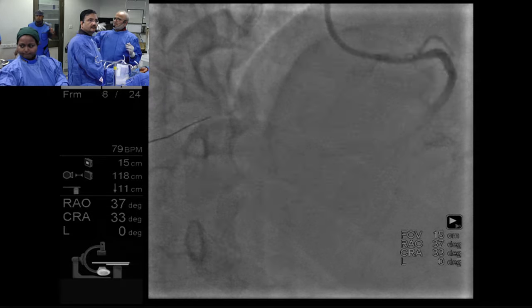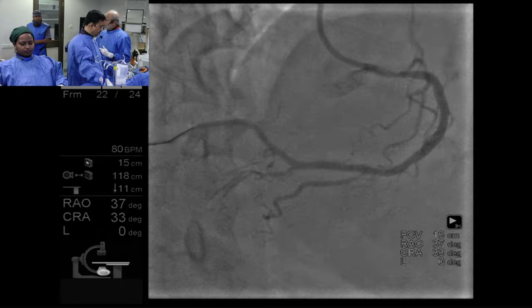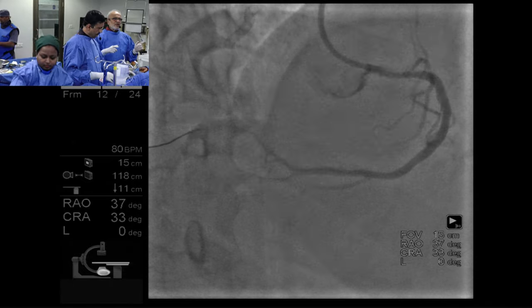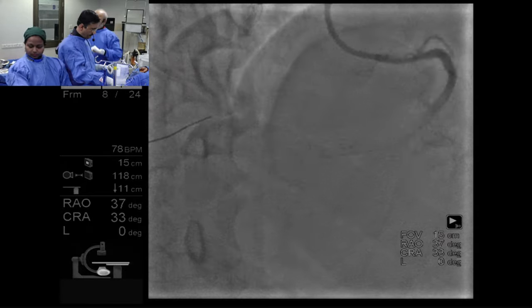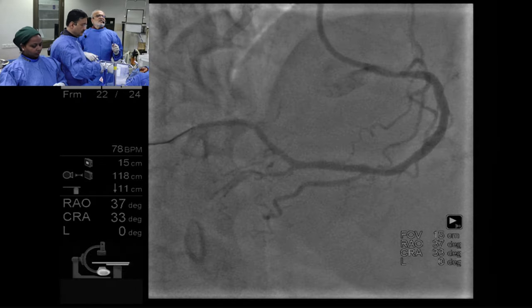The live transmission, we are going perfectly on time. Let it be in that lab and OCT. Or do you want to see OCT? Yes, we would like to see OCT. Okay, fine. Ostial. Another 1 minute. Wait. Yes, ostial RCA is just very important.